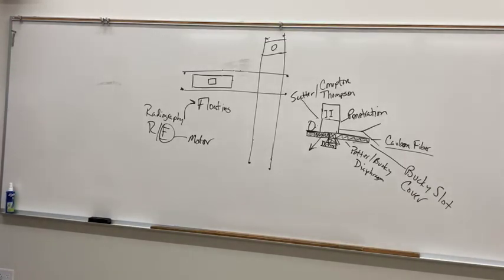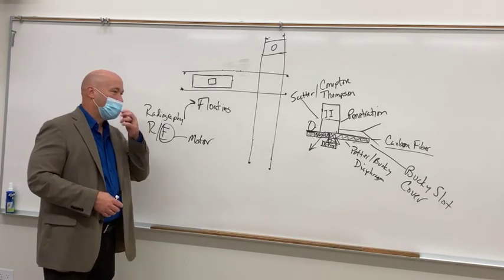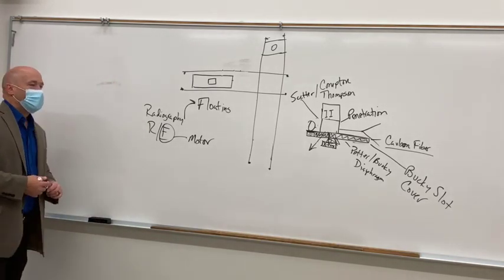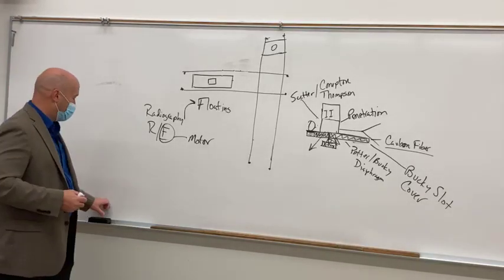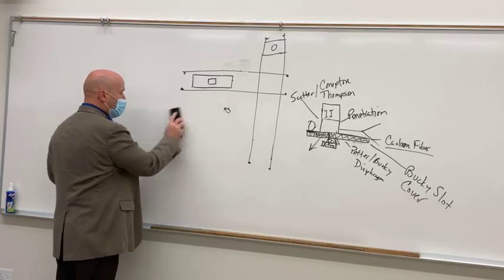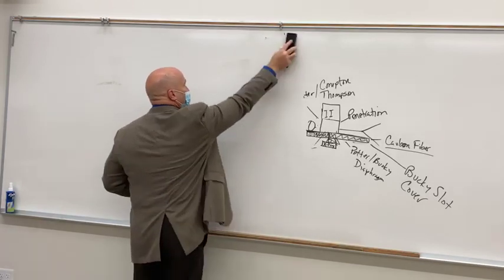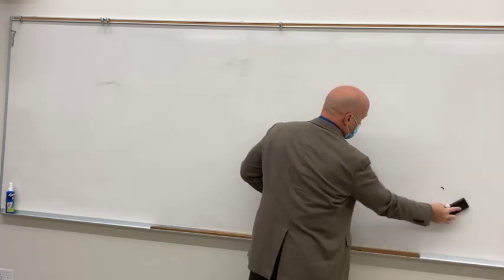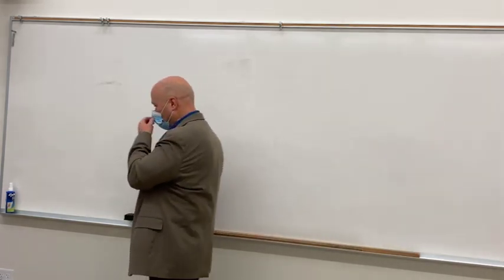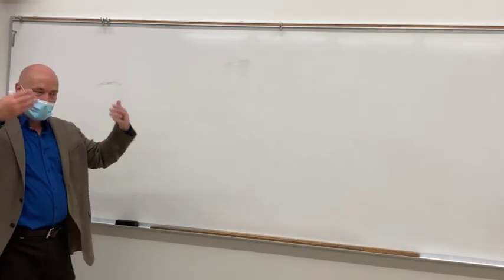No? All right. So regardless of whether you've got a mammo unit, a radiography unit, an RF unit, even a therapy unit, basically what you're going to have you can break down into three sections. So what you've got is the operator's console. The operator's console is the only portion that is always going to be in a place where you can get away from radiation exposure. So in a diagnostic room, fluoroscopic room, RF room, that's going to be outside the room. So it's behind the glass.